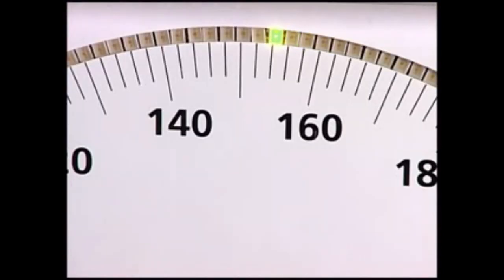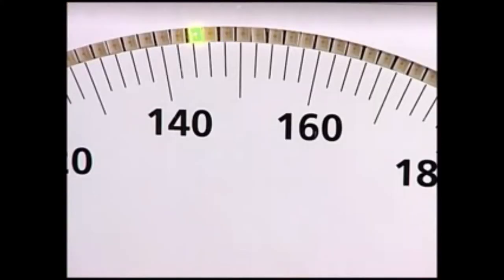Note the reading of the systolic pressure when repetitive clear tapping sounds appear for two consecutive heartbeats. The American Heart Association recommends that measurements are recorded to the nearest 2 millimeters of mercury to prevent inaccuracy caused by digit preference.